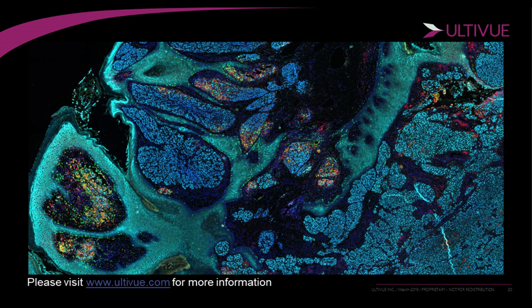Dr. Patel, are the stained slides archivable? So we are looking at the stability of our stained tissue slides, and right now we've shown stability for over 8 months, stored in the dark at 4 degrees. So I'm not sure how long the archival data would be good for past that. We're understanding how long these are good for as time progresses.